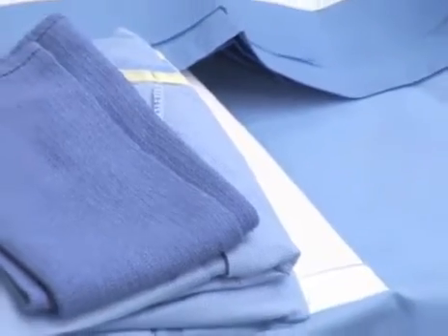Strike-through contamination occurs when a drape becomes soaked during surgery and solution penetrates to a non-sterile surface. Whenever possible, use only impervious drapes. Drapes fitted with a pocket reservoir and drainage system are used for cases in which extensive fluids or bleeding may cause strike-through.